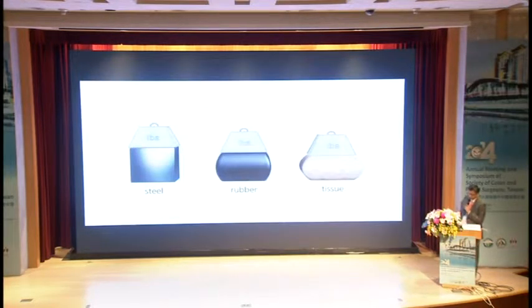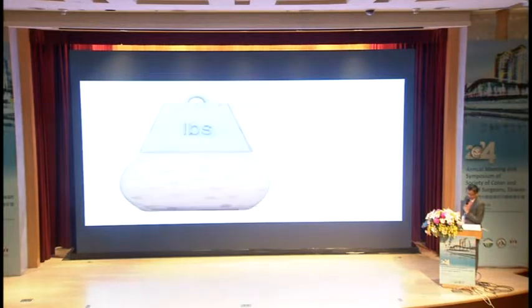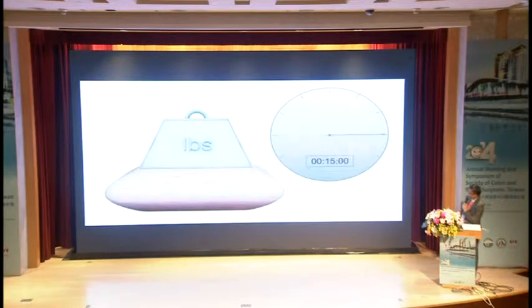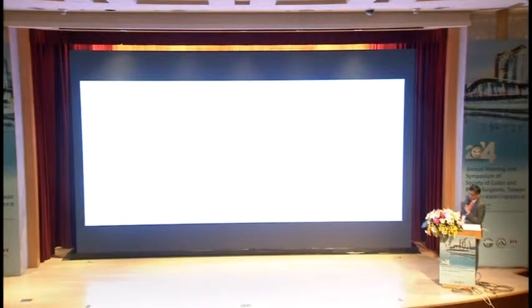In these videos, we know that at the initial pressure, tissue is still not completely compressed. But as time goes by, around 15 seconds, the compression may migrate fluid from tissues and ensure a more consistent thickness. So after compression, tissue is ready for a secure staple.